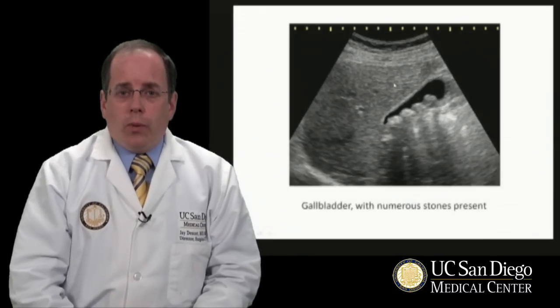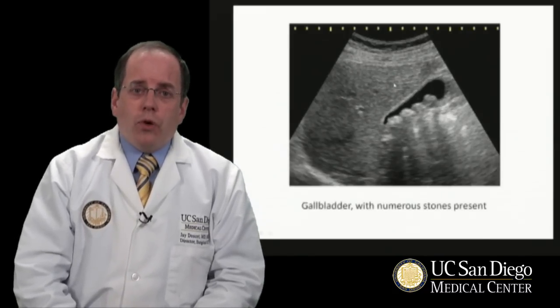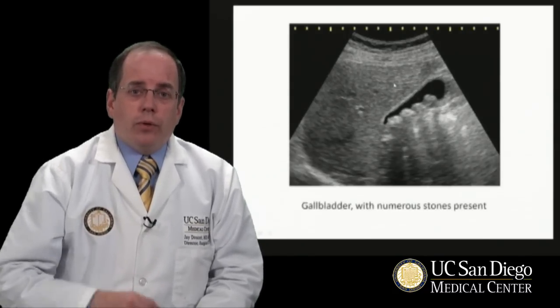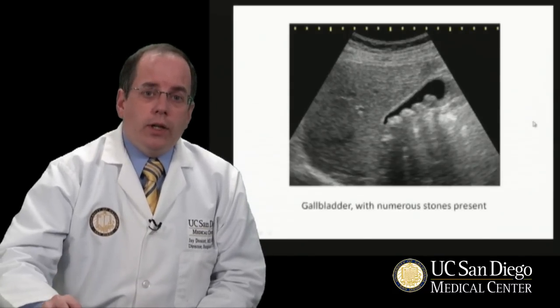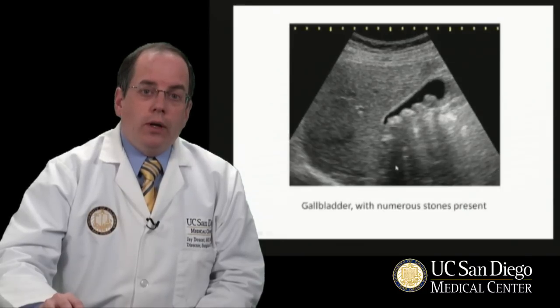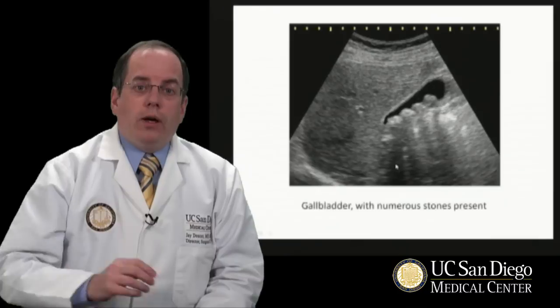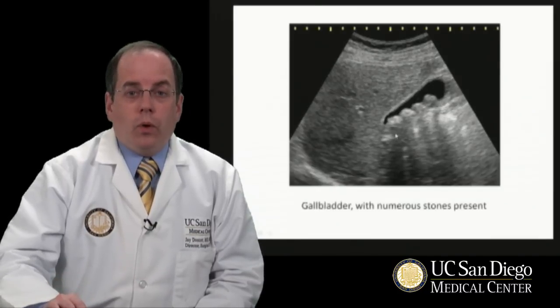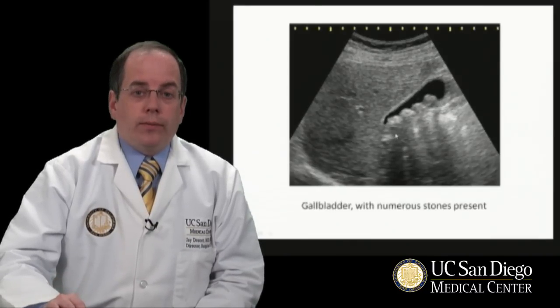Here's the gallbladder with stones. The stones usually have bright reflectivity, and you can see they're quite bright here. Behind each stone there's acoustic shadowing, which is pathognomonic of cholelithiasis.